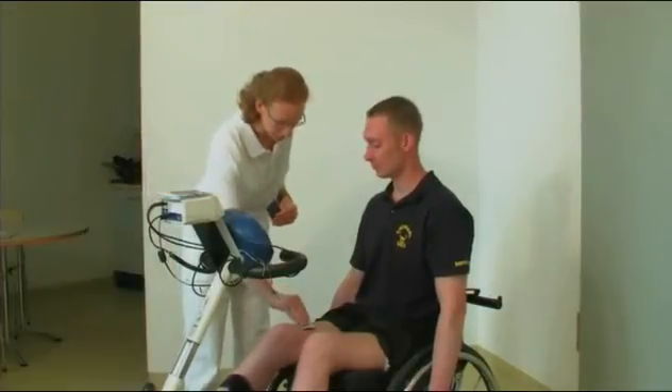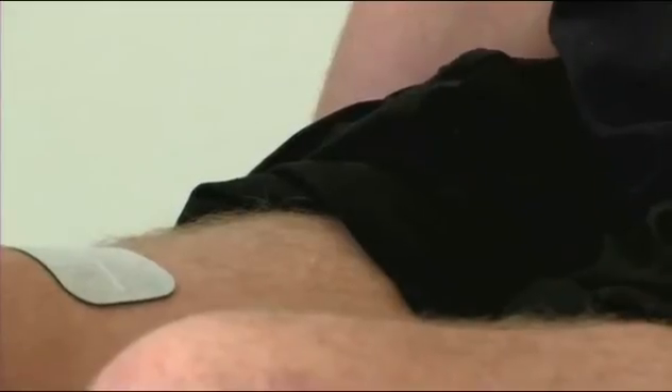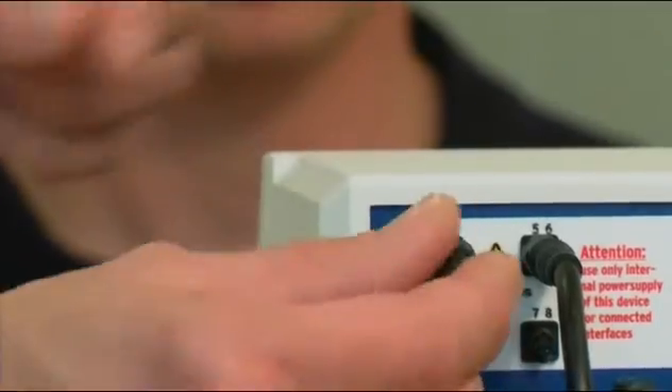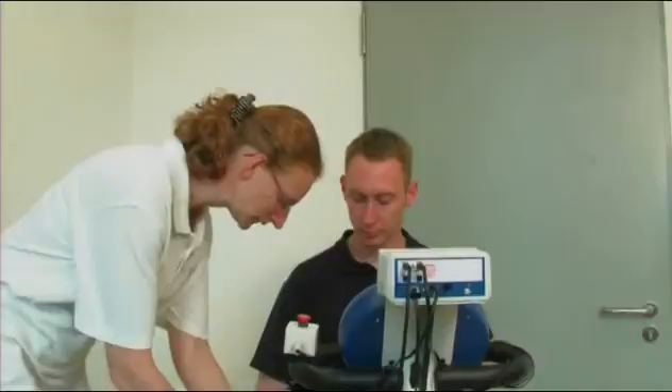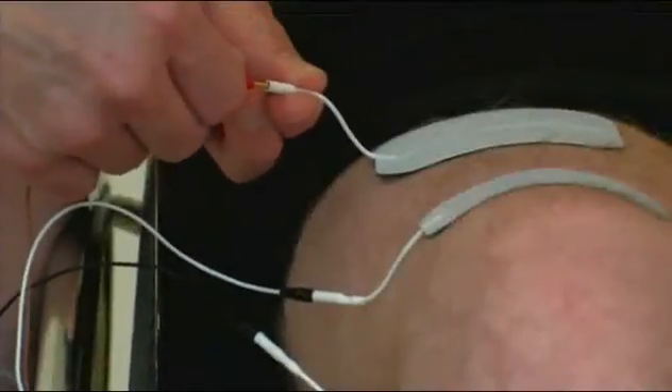With each muscle group, two self-adhesive electrodes are placed onto the muscle abdomen with a slight distance between them. The RehaMove control is equipped with eight channels of stimulation, meaning that up to eight muscle groups can be stimulated simultaneously.